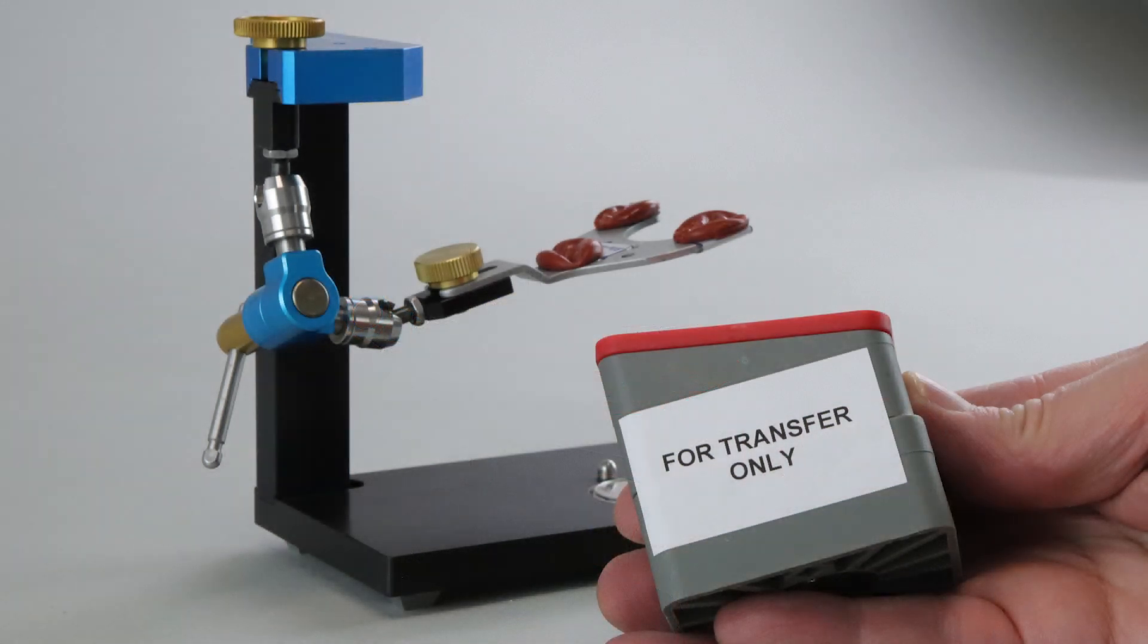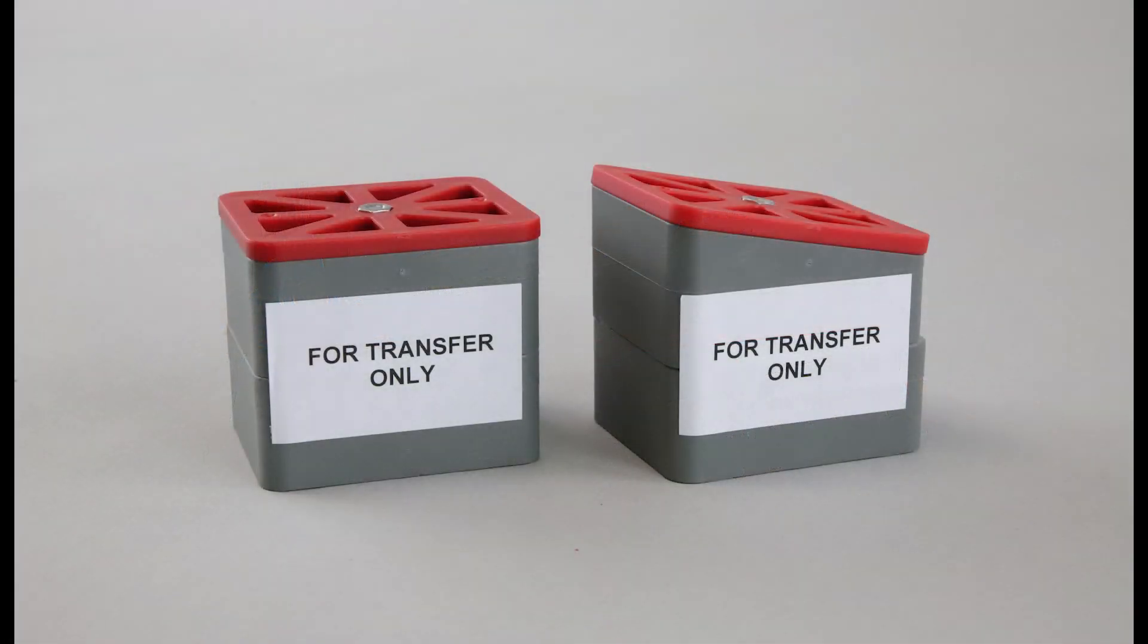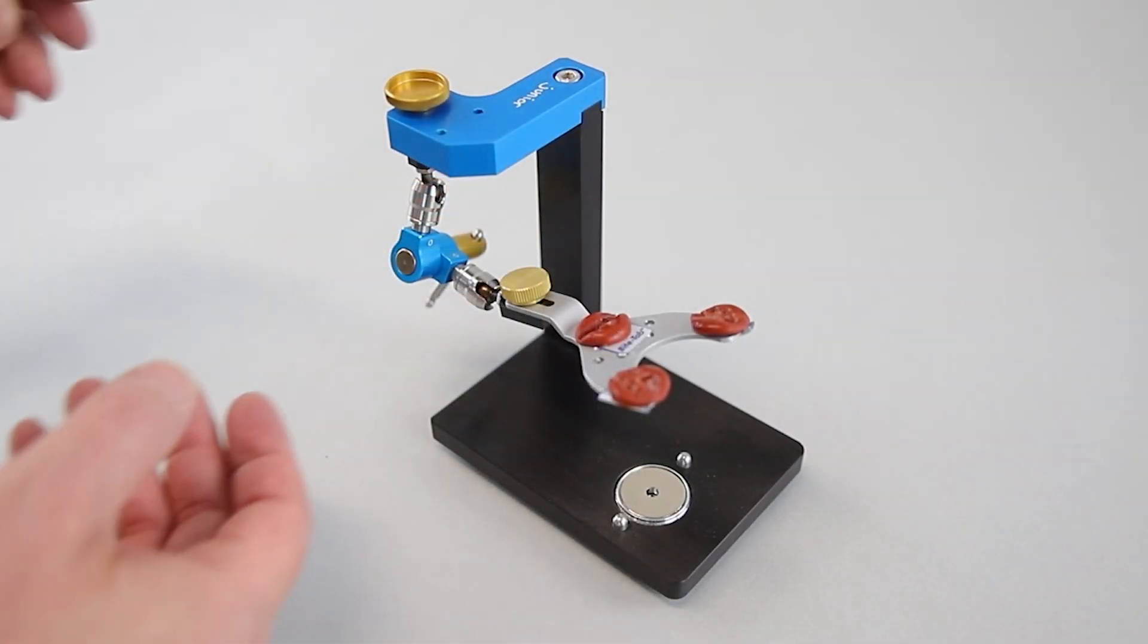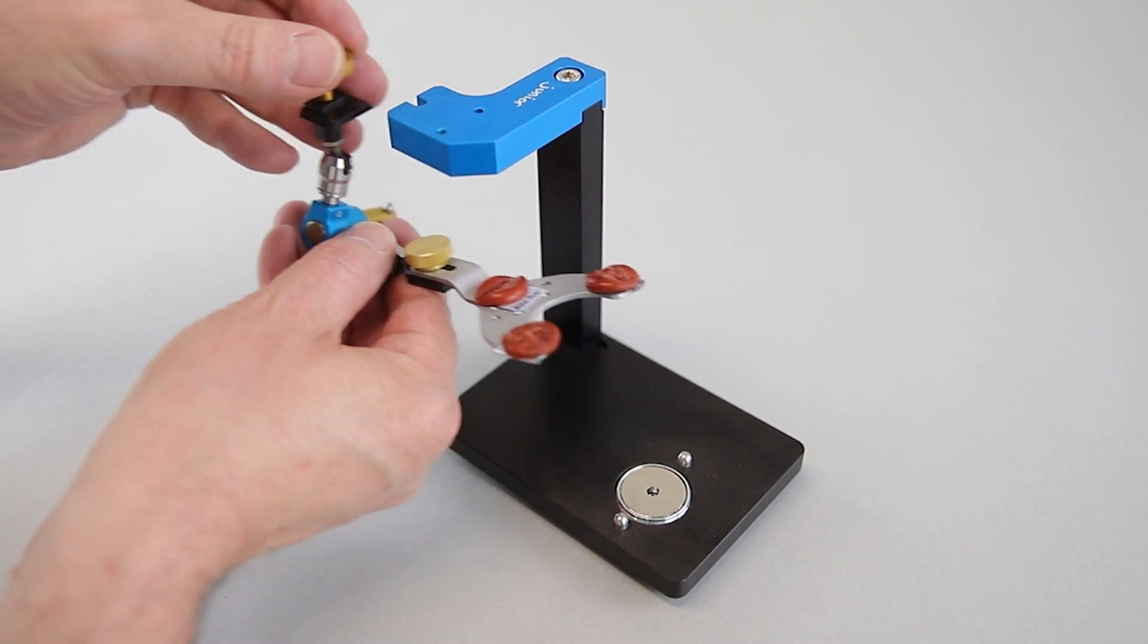In case the standard blocks are too small, you can use distance blocks which are used for transfer only. Remove the 3D joint support and fix the distance block into the Transfer Stand.